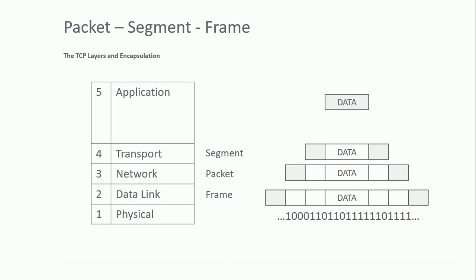So that's the concept of encapsulation. Again, it's really important to understand encapsulation. I'm going to talk here about all 3 of these middle layers. Before I talk about DICOM, I'm going to talk about transport, network, and data link.